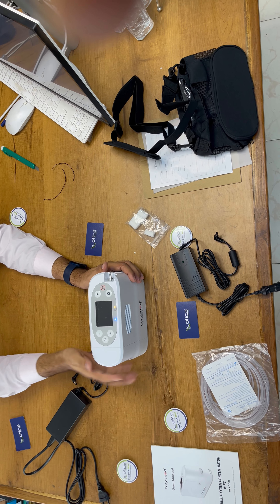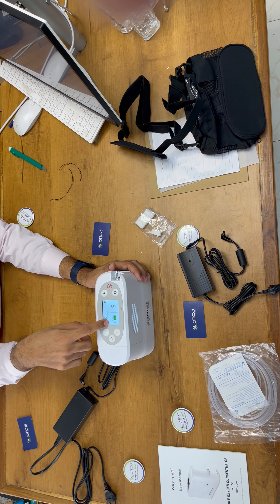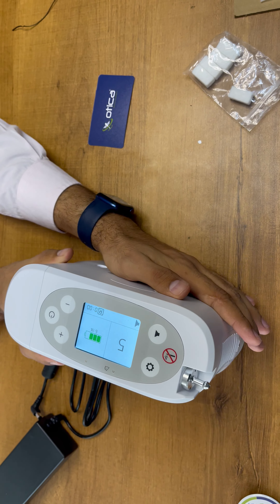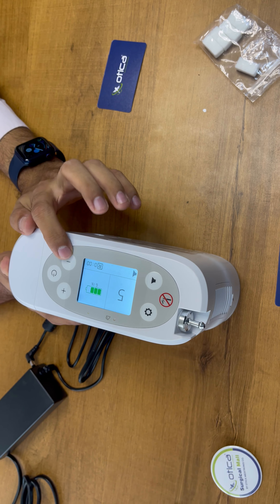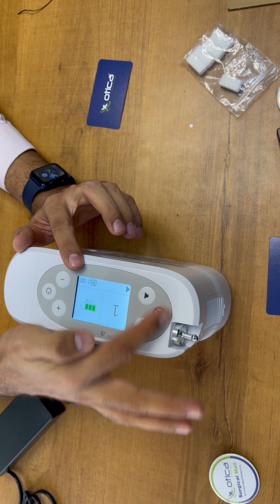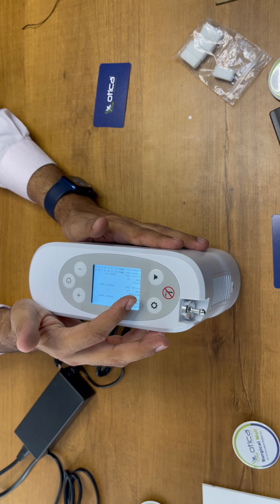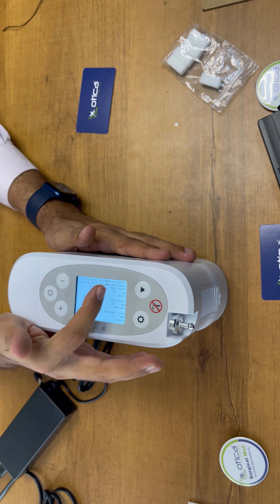Now the device is ready to use. To switch it on, press for one second — it will show the OxyMed welcome message. It shows the battery indication, the total run time of how long the device has been running, and the flow rate adjustment. This machine gives a flow rate up to 5 liters per minute — four, three, two, and one. You just need to operate with three buttons. The setting button shows company information: battery model, molecular sieve time, running time, test time, temperature, and firmware/software/hardware model numbers.